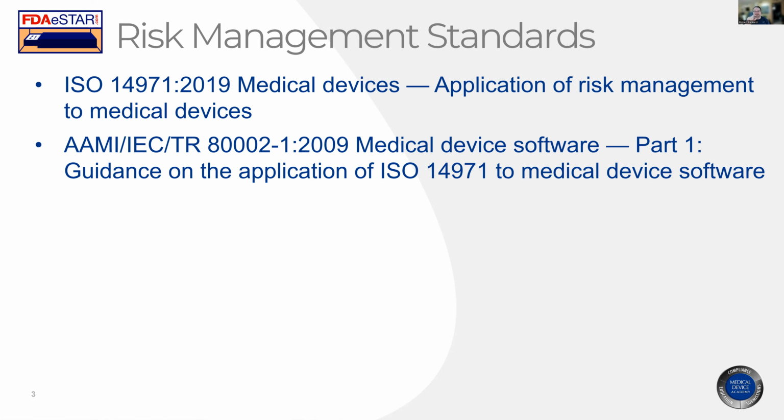When I get these little itty bitty tiny risk management tables that look just like a design FMEA that they learned from 14971, and it's got three or four lines, that's not going to be adequate for the software risk management file that you have to submit to the FDA. They are no longer letting you get away with just a software hazard analysis. Now they want you to provide the whole risk management file for software. So they've raised the bar a lot in 2023.